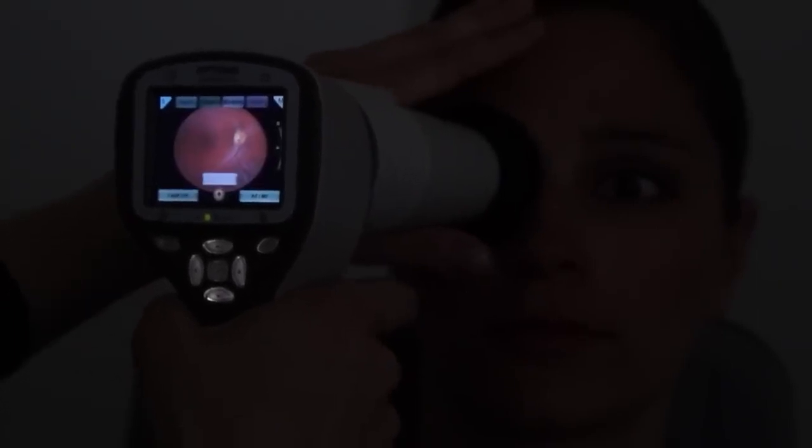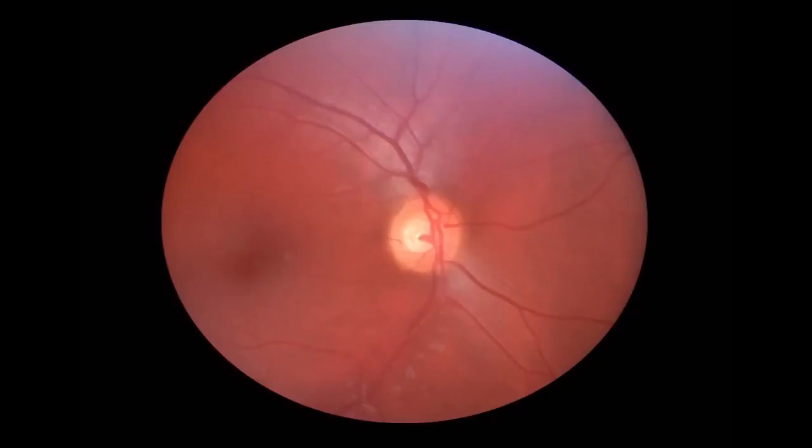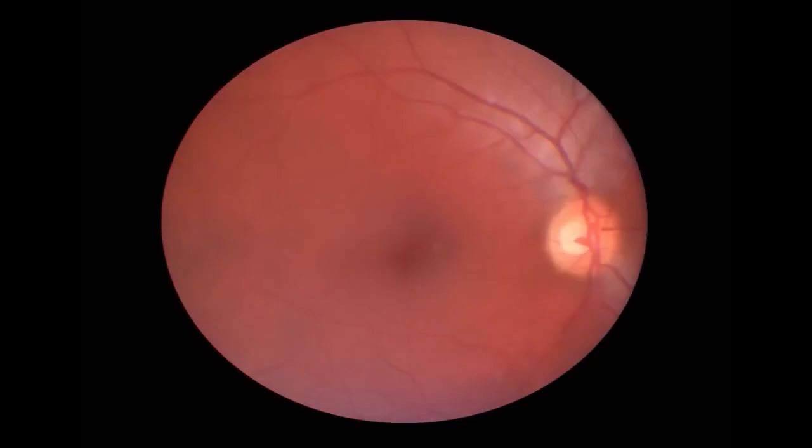Capture image by pressing the shutter button. In order to ensure a good quality of examination, you should take multiple images. By trying different illumination and focus levels, you can find the optimal settings for each individual patient.